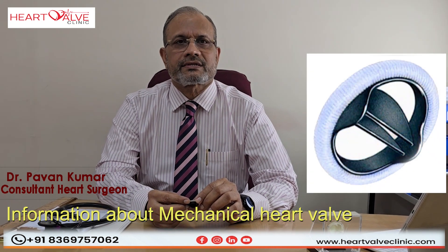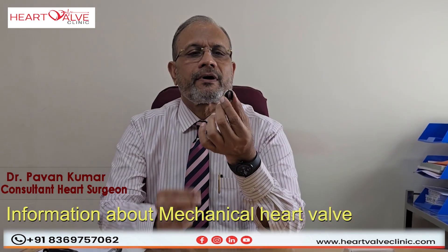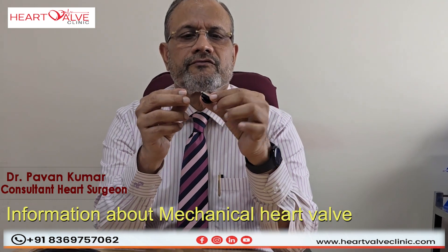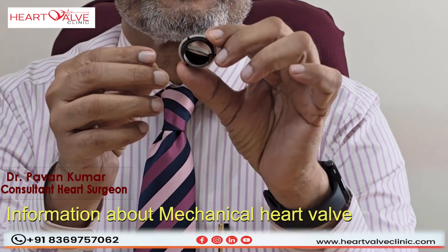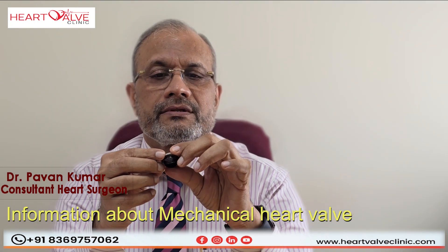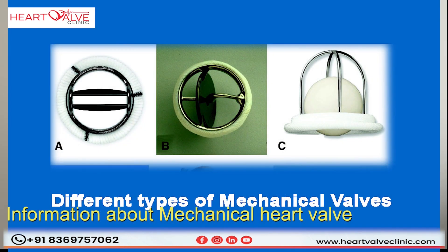As I told you last time, mechanical heart valves are made of steel and pyrolytic carbon. These are the oldest heart valves which were used to replace the original diseased heart valve. When they started off, there were different varieties of mechanical heart valves.